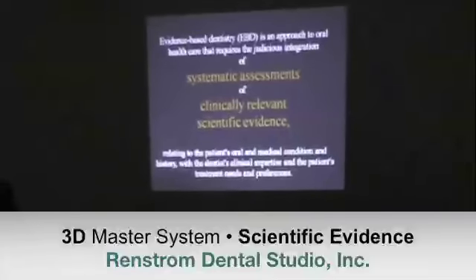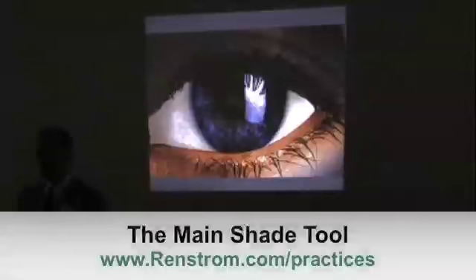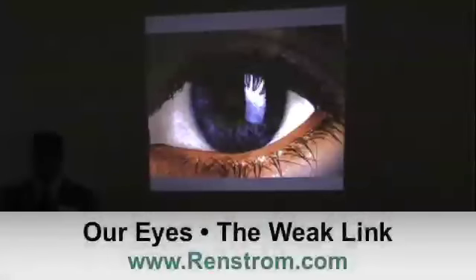Not "my sales rep said this patient worked this way." It's a tool we use to take shades, whether we use Renstrom Lab, whether we use Vita porcelains, whether we use an unusual shade guide. We all use one tool, and that's our eye. Unfortunately, that's the weak link in the chain.